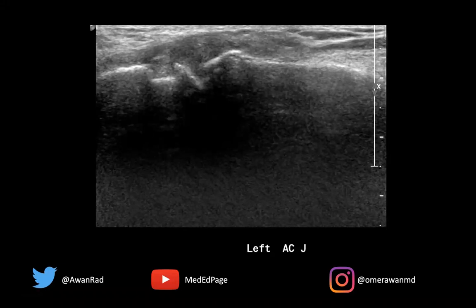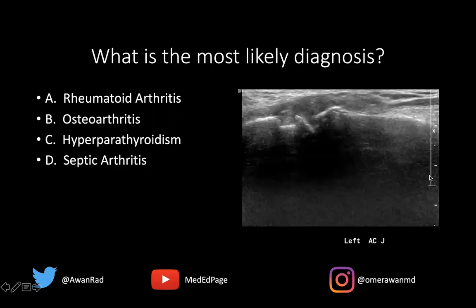Hello everyone, and welcome to MSK Unknown Case Series, case number 61. We actually have an ultrasound case. Ultrasound is one of my favorite modalities in musculoskeletal imaging. We have an ultrasound image of the left acromioclavicular joint. The question that follows this image is: what's the most likely diagnosis?